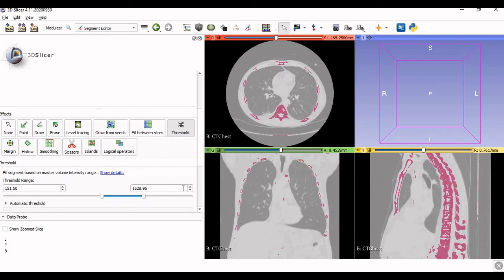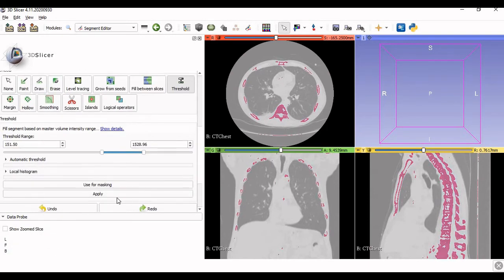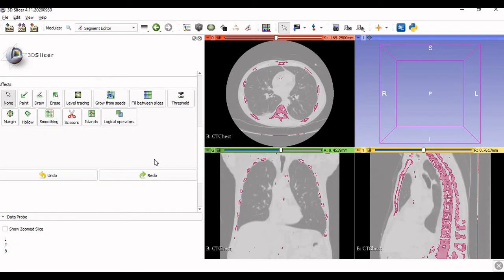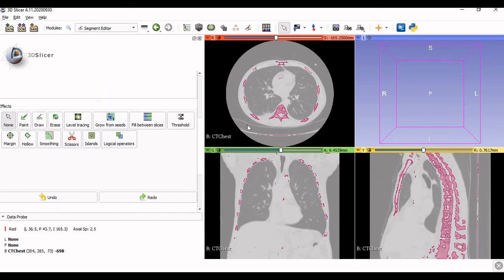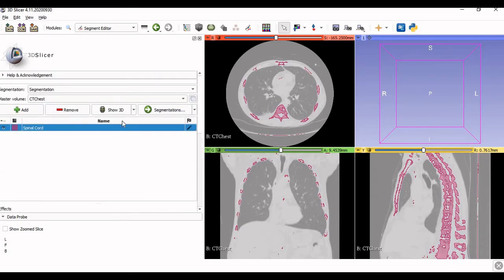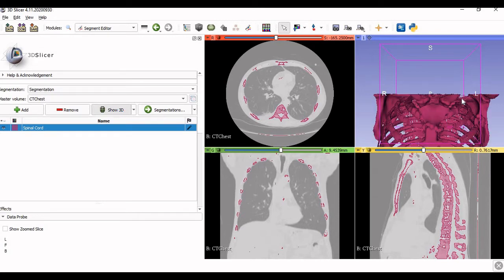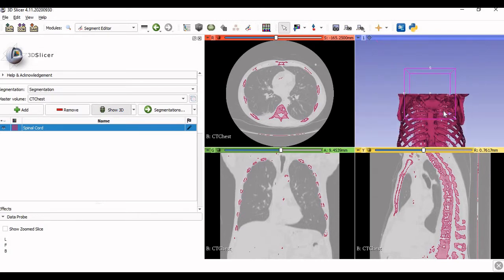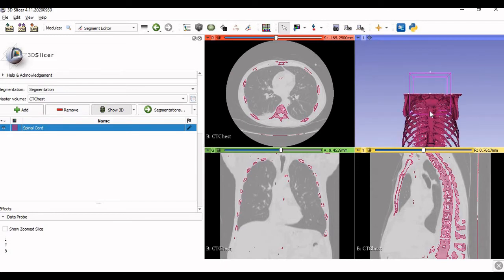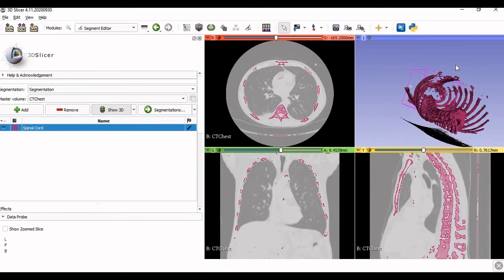Once you have done sufficient adjustment of the threshold value so that the required area is highlighted, click 'Apply.' After you apply the threshold value and the geometry is selected, you can see the 3D view. Scroll up and click 'Show 3D' — depending on your system it will take some time to generate. The 3D model will appear in the window and you can left-click to rotate and examine it.